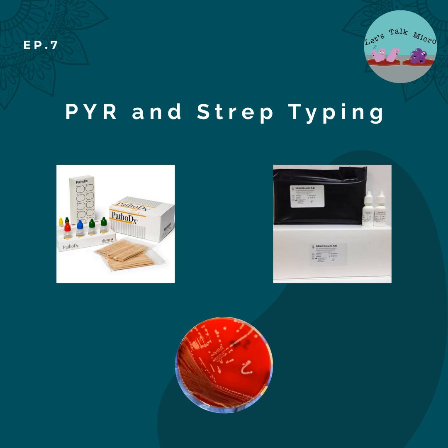And like I mentioned before, agglutination is a positive result. The latex in this test is blue, so you're going to see blue clumping. Like I mentioned, it's a very simple test. Take two to four colonies, add the colonies to a card that already comes with a circle, add your latex, mix it, and then rotate for about a minute, and then observe for agglutination.